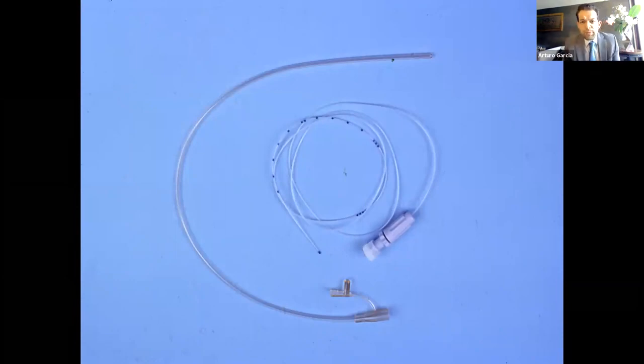So what do we use to measure vesical pressure? In Mexico, I use a double lumen catheter. And I use a 7 French dual lumen catheter because it's just easier. I don't get the correct gauge of the epidural catheter they use in Bristol. But this is the way they do it in Bristol. They have a UPP catheter, a single lumen UPP catheter.